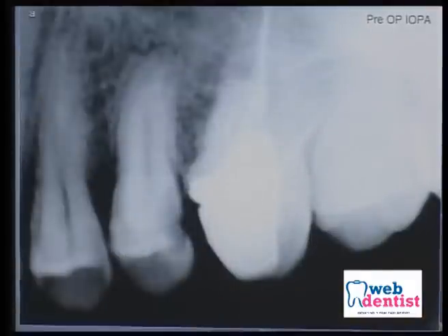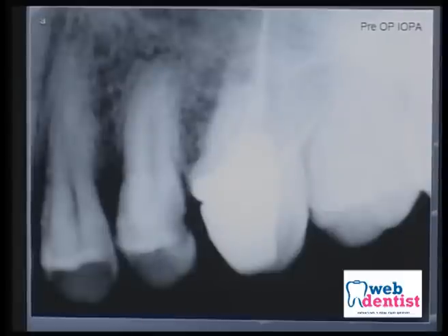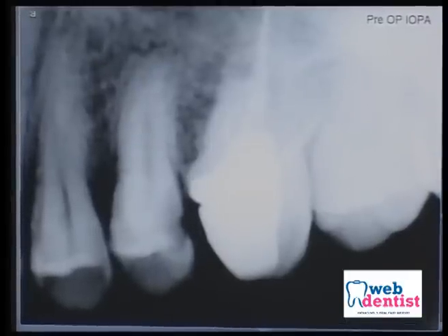So this is his pre-operative X-ray. On the X-ray, you can see the 6 has been treated in the past, and the 5 is the one in question right now. It's not a very difficult case. We decided to take an easier case, and especially a premolar, because here it will be easier to show you all.